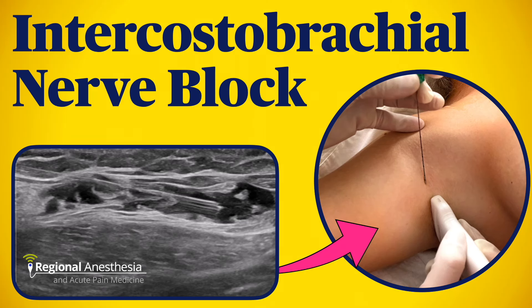The skin on the inside of the arm is innervated by two small nerves: the intercostal brachial and the medial brachial cutaneous nerve. There are several reasons to want to block these, and in this video we'll go over the anatomy, sonoanatomy, and approaches to blocking these two nerves.